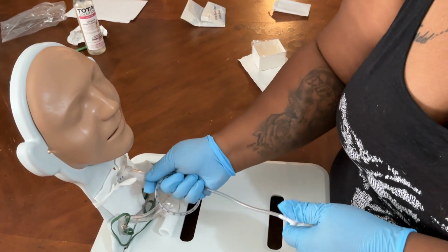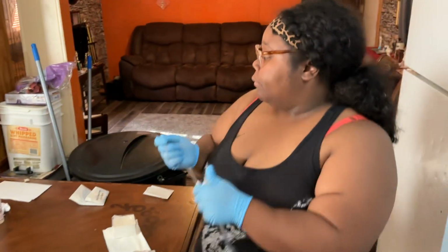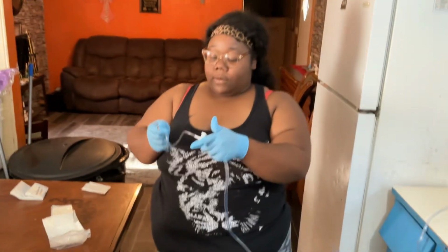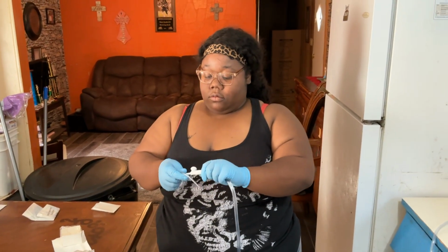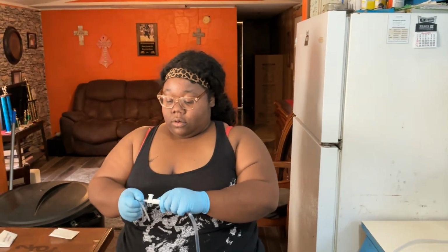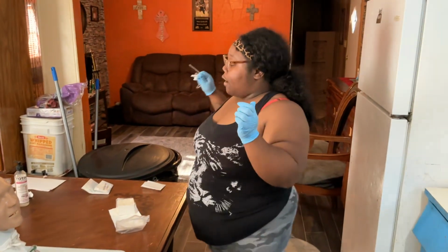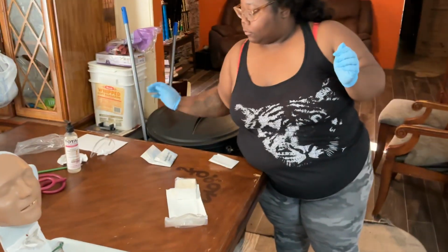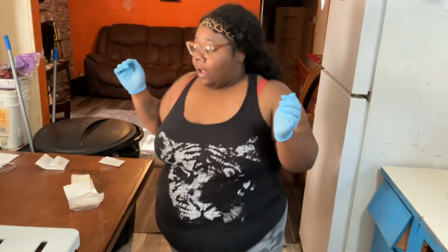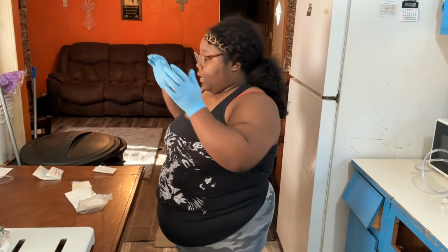Alright, and here's some of that coming out. Got it out. So what I'm going to do now is discard of this. I will discard of this in the appropriate bin. Now that I've done that, I performed trach suctioning. We did get a good bit of secretions out.